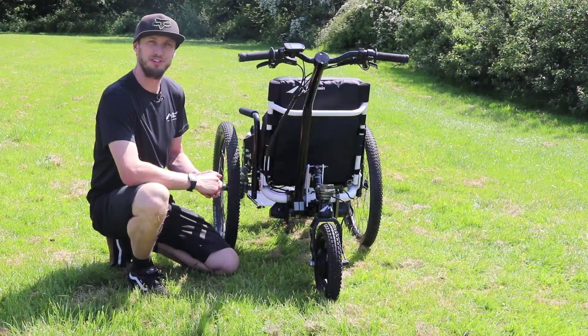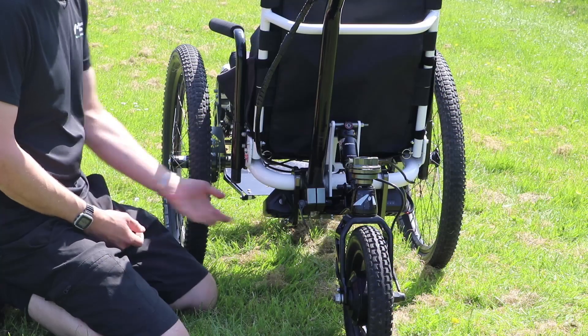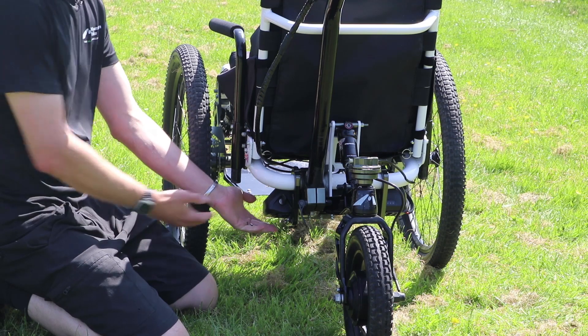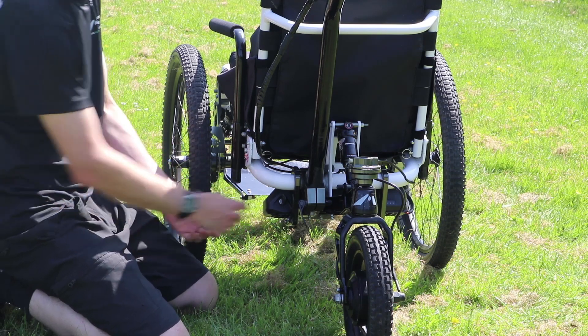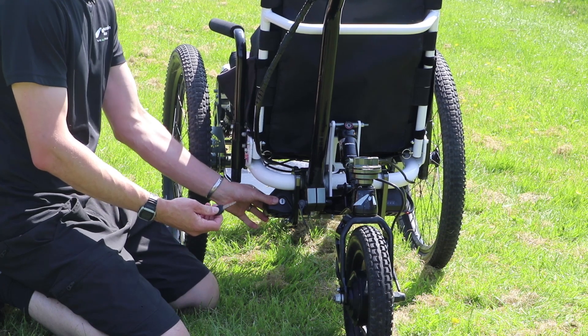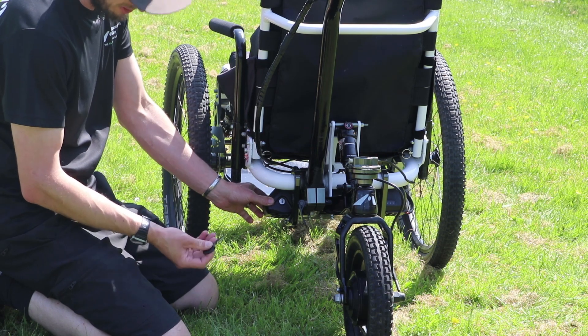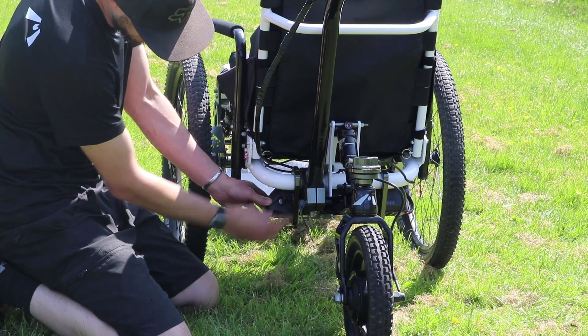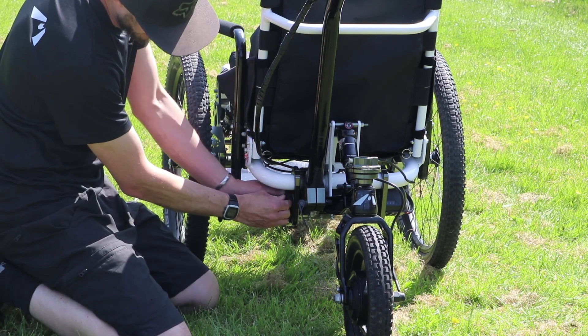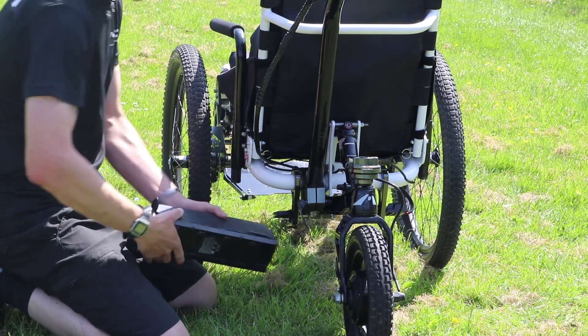I'll now talk you through the electric assist features of the E-Push. The battery is mounted under the seat of the trike. The key is purely for locking the battery in position on the trike — it has nothing to do with turning it on or off. So to remove the battery, you put the key into the lock, turn it 90 degrees and slide the battery out of position.